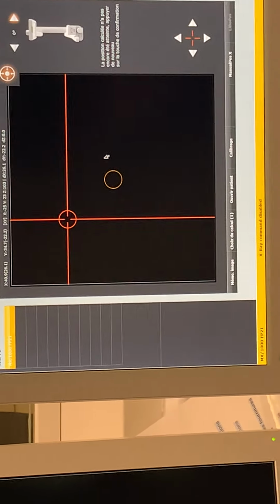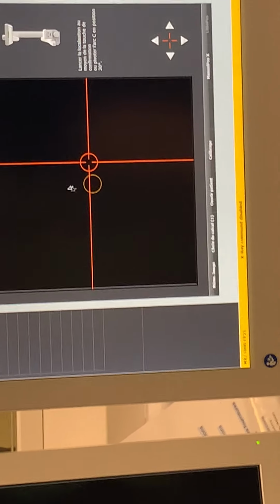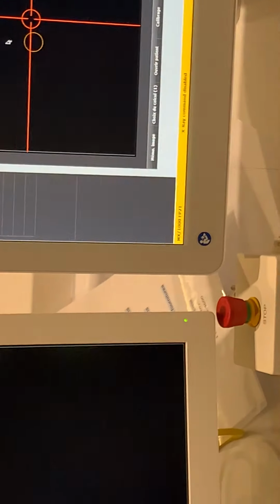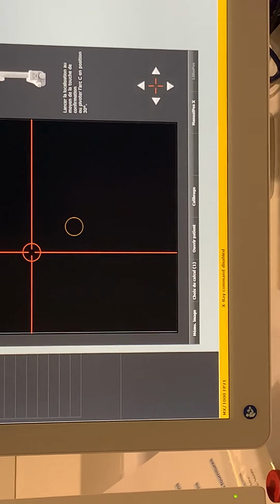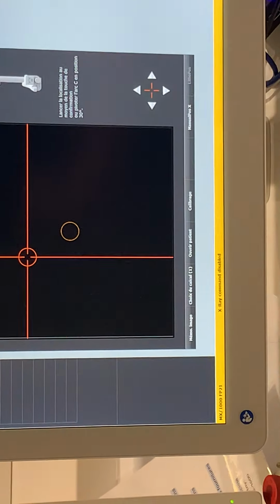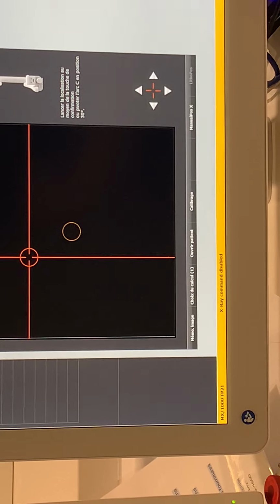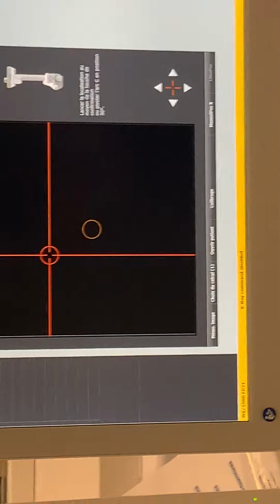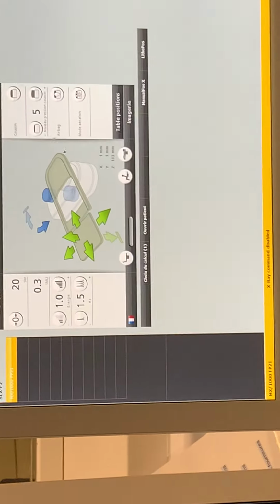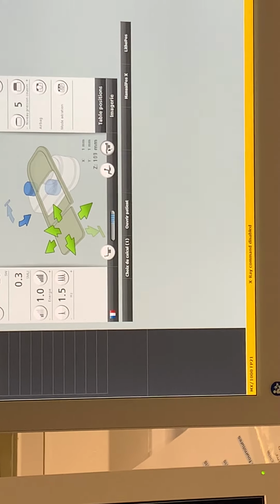We are now at 0 degrees. You do the X-ray. Say the stone is here, press on it, and now I need to go to 30 degrees. Now the C-arm is normally... What is it saying? The table is too low, because normally the table is in another position.